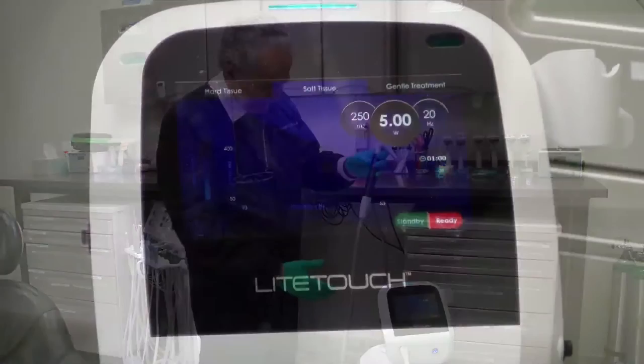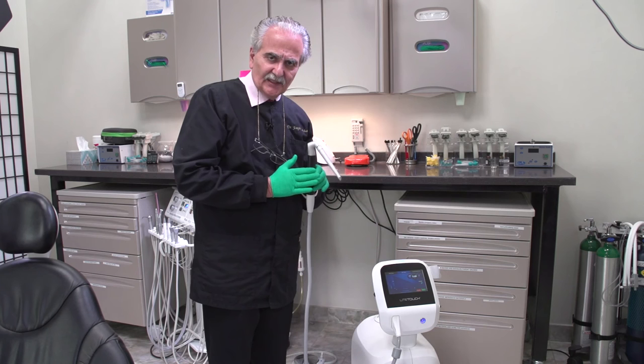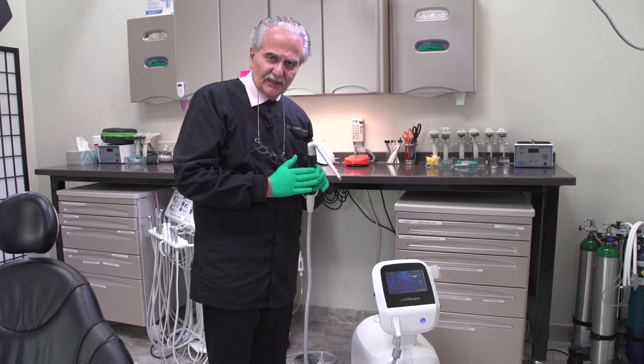Look how small it is and how easy it is to utilize. With the touchscreen, you can select whatever procedure you want and it will automatically set the water spray and the amount of power coming out. I hope you enjoyed today's tip — tomorrow I'll give you another one. Thanks!